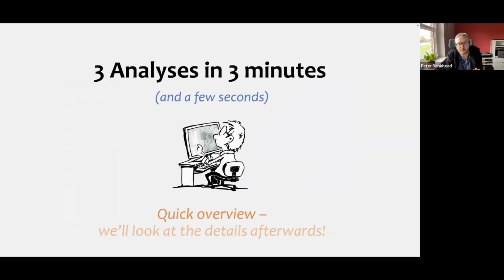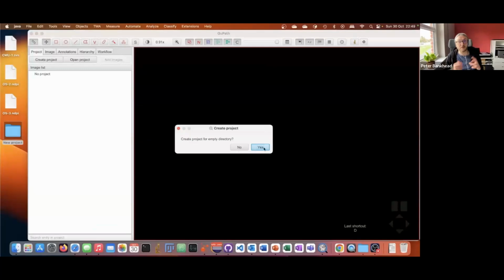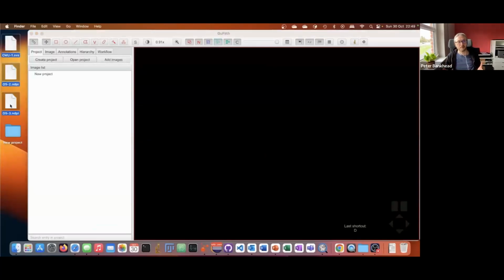I guess some of you might have seen this before, but I'm assuming that a lot of you probably won't. The last thing that I'd like to do, just in the justification for why you might consider QuPath, is to show you a very quick video of 3 different types of analyses in 3 minutes. All of these are focused on whole slide images, but it gives you a flavor for what QuPath can do.